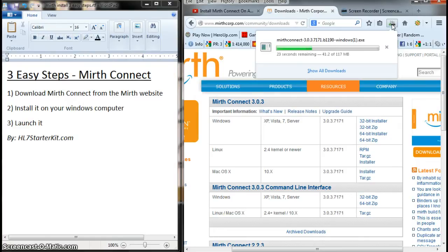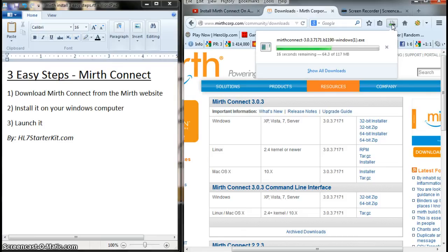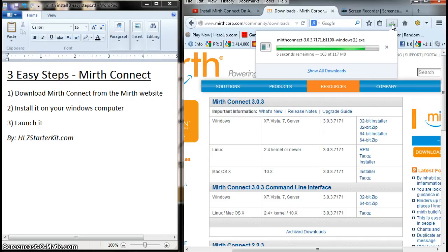It's relatively quick. It's 117 megabytes, so it's a pretty large executable file. But this is all you're going to need in order to use Mirth Connect, so no worries. Just download the executable, and once it's done, you just launch it.